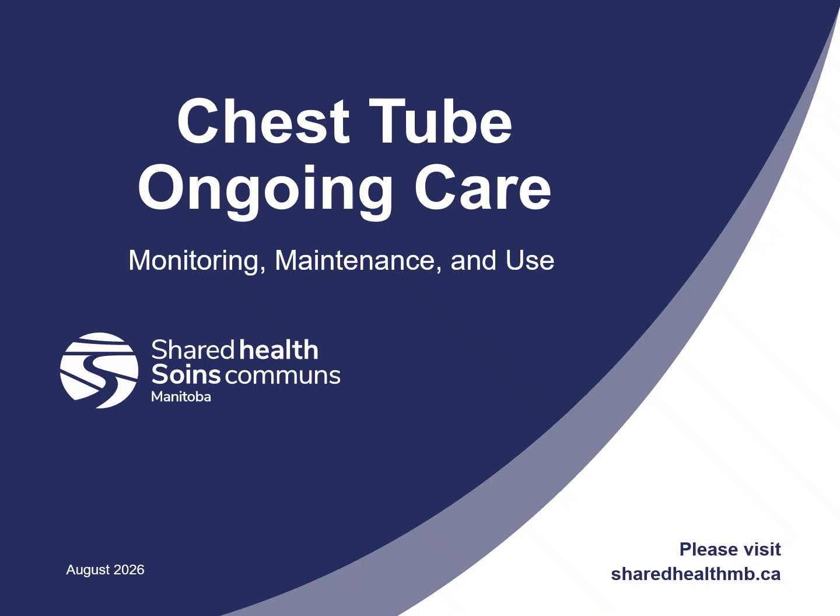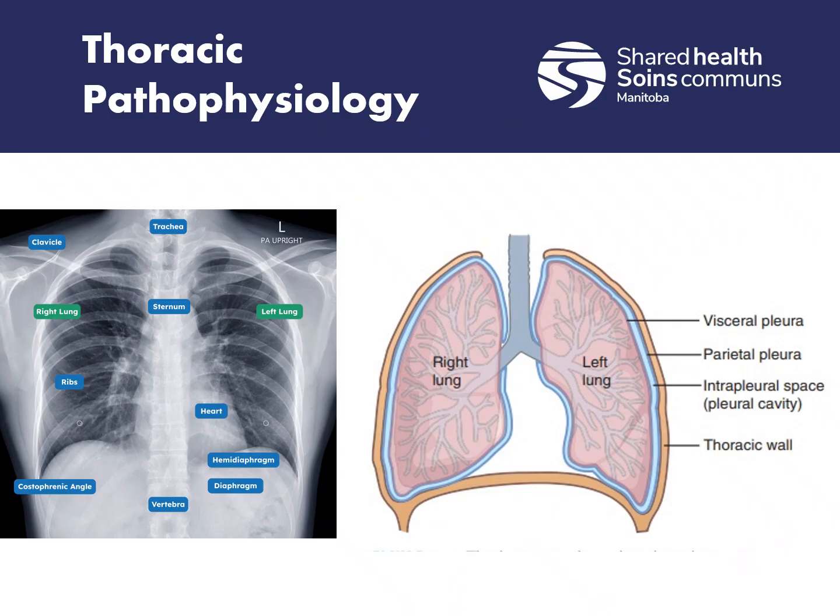Hello, and welcome to this presentation on chest tube ongoing care, monitoring, maintenance, and use. Before we get into chest tubes themselves, we're going to look a little bit at the thoracic pathophysiology.